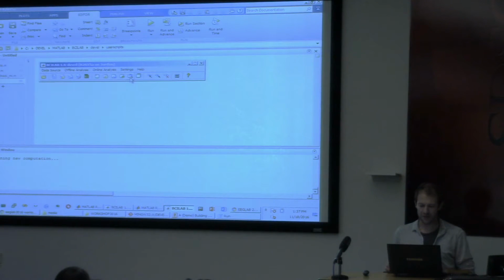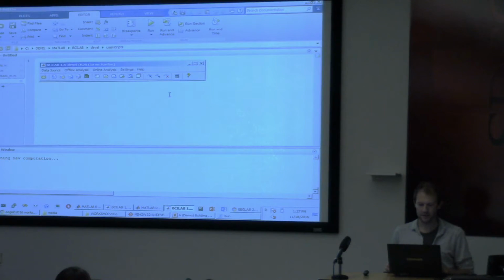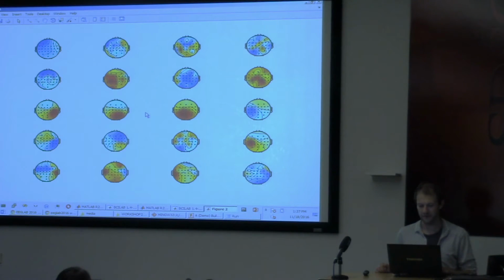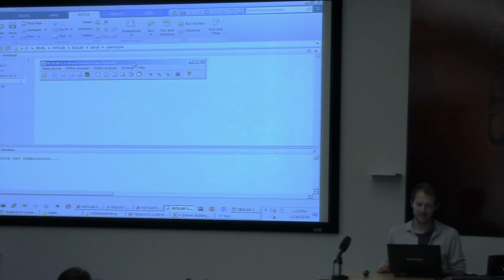And I could visualize the model now, for instance. Let's do that. So what this gives us is spatial patterns that correspond to different brain sources that this algorithm identified. So when you look in this row here, for different frequency bands, by the way, that's inherent to the method, there are a few good ones in there, a couple junk ones. These here correspond to sources in the motor cortex, which it found. That was pretty quick.